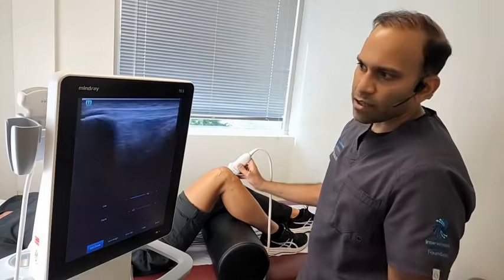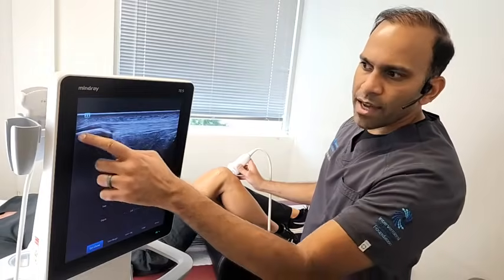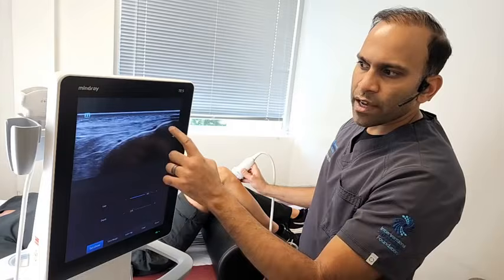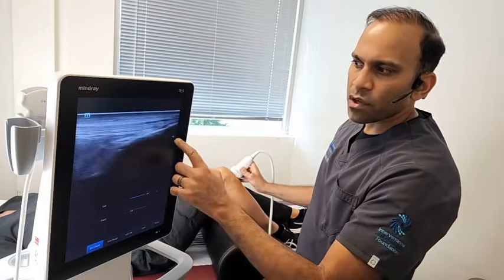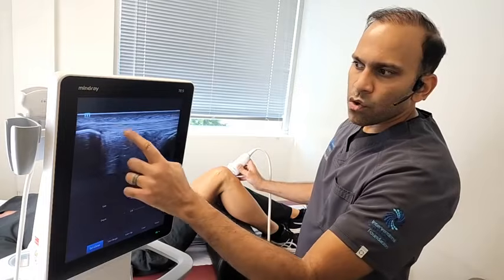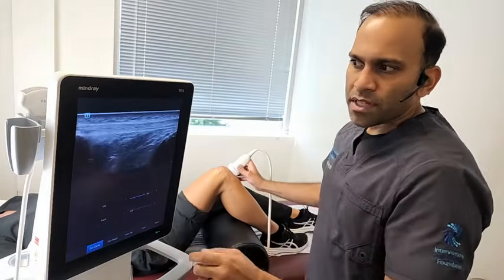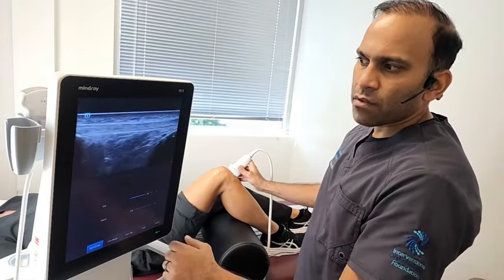All right. Now from here, I'm actually going to go below the kneecap into what's called the patellar tendon. So the patellar tendon over here is where the kneecap meets the lower leg. So this whole structure right here is the patellar tendon. And the patellar tendon, again, you have the nice fibrillar linear pattern of the tendon.